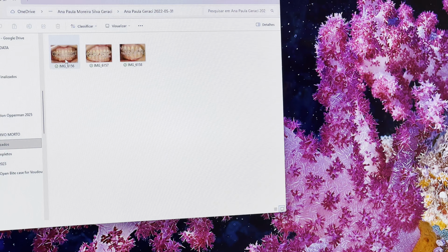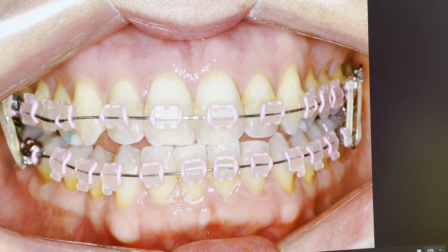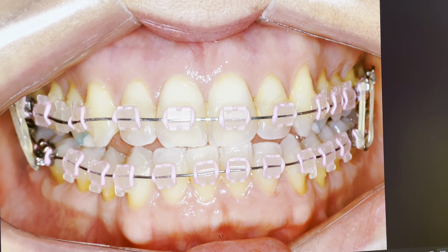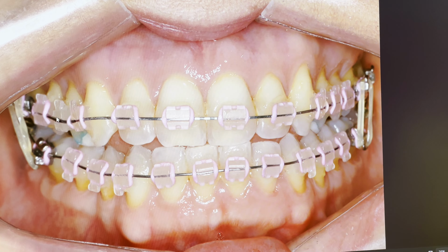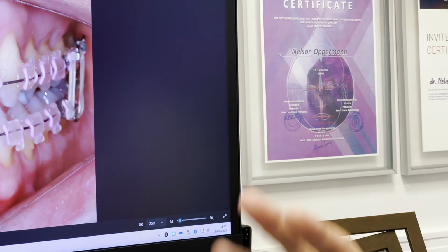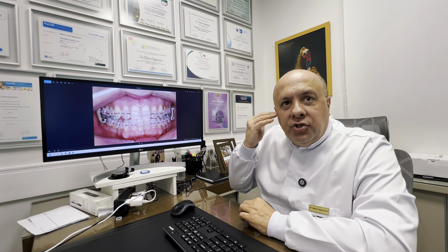If we jump in time here, the patient can place elastics to help join the teeth. And the vertical elastics in the posterior area are not a problem anymore because we have the overlays holding the condyle vertical. So this is just a dental movement. I have no chance for compression on the joint.